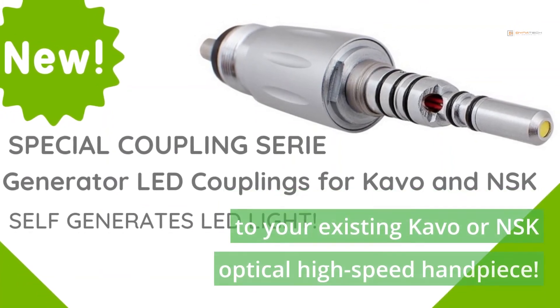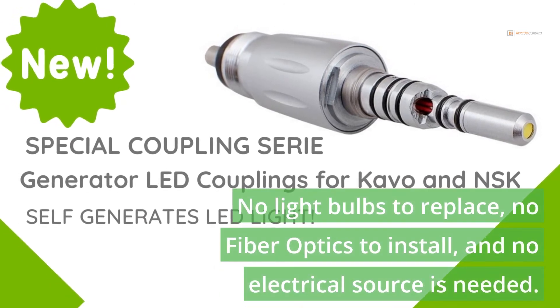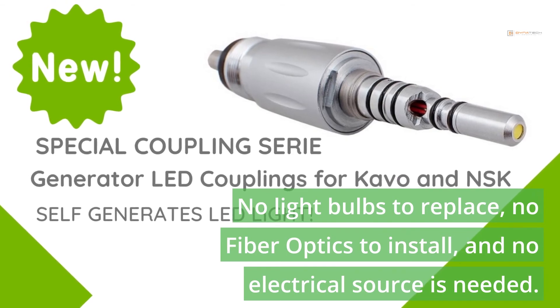Connect to your existing Kavo or NSK optical high-speed handpiece. No light bulbs to replace, no fiber optics to install, and no electrical sources needed.